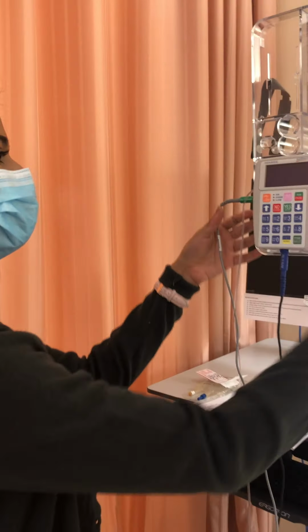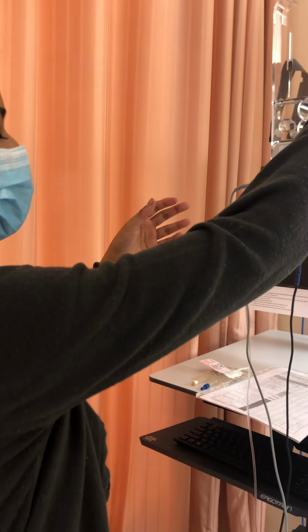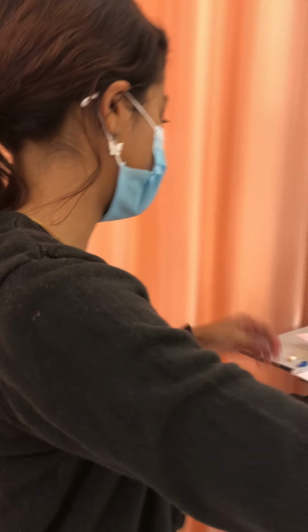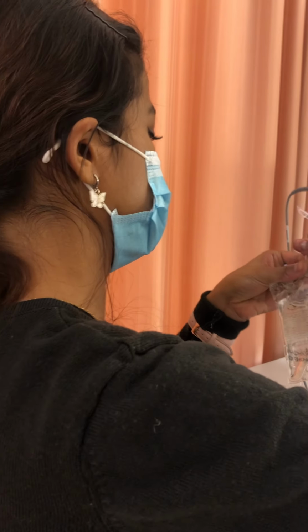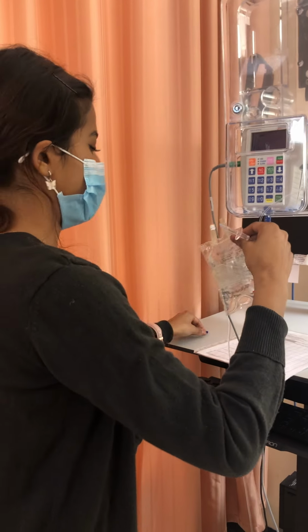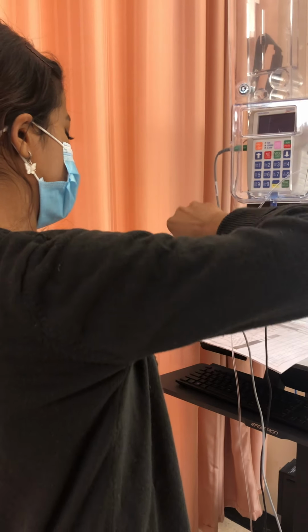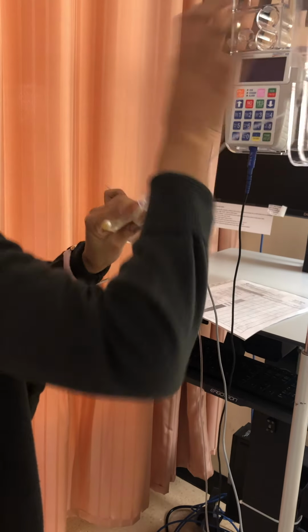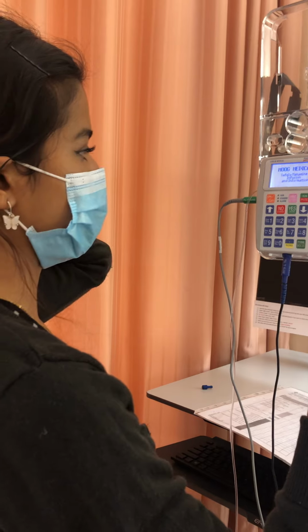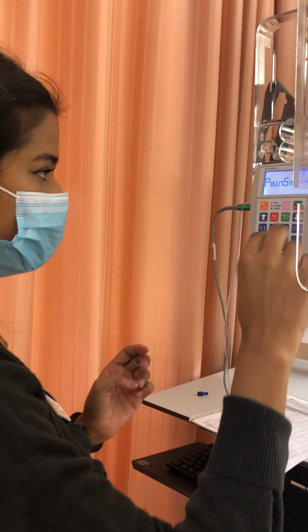quickly change the bag. So remove the old bag, that is done, and I will attach the new one. So aseptically attach it to the spike. Okay, so we're good to go with this, and I'll just put this up over here, and I'll turn this on, and then it's going to ask me for a code, which I have on the back, so I'll make sure that I put the code in, so it's just going through.